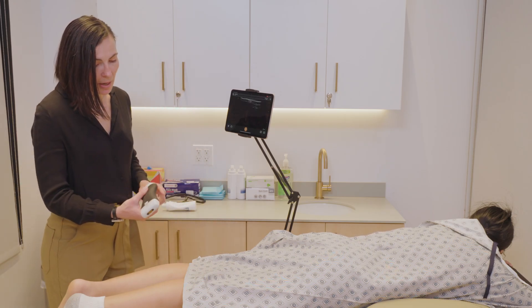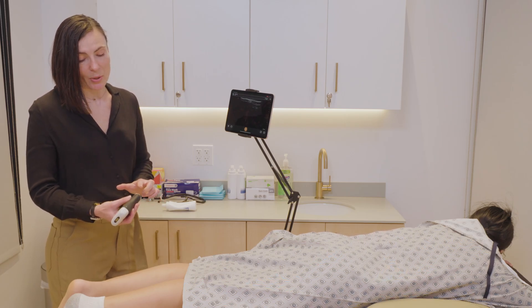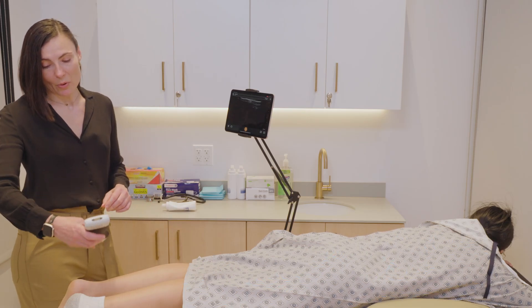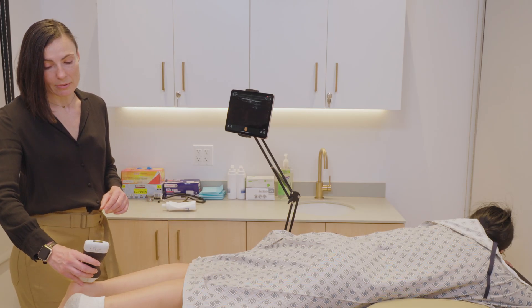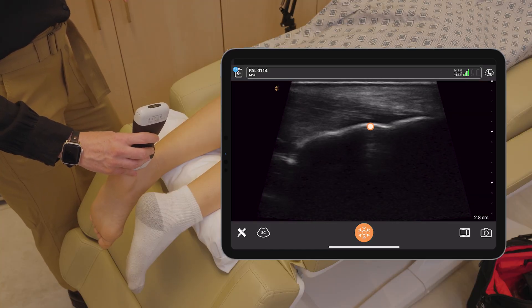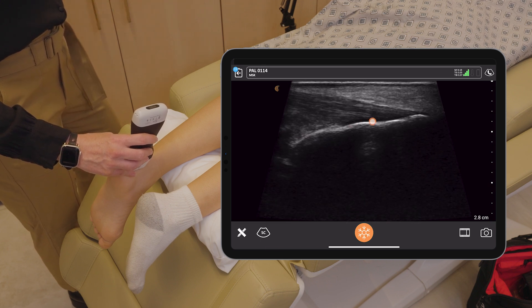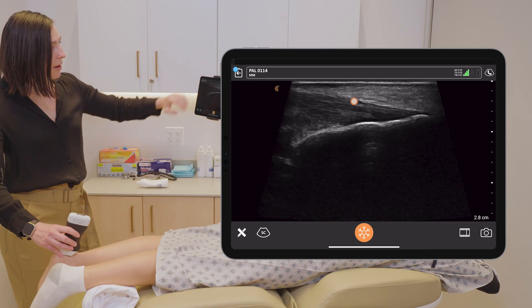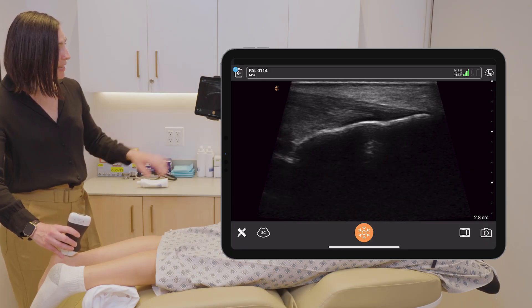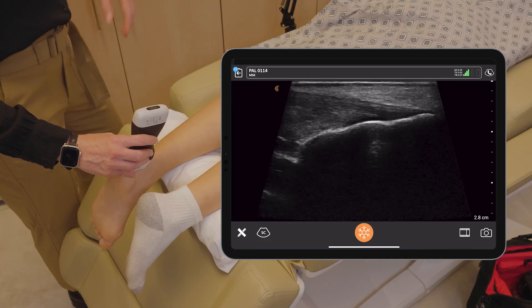I'm going to start with the sagittal orientation first, and my probe marker is going to be pointing towards the patient's head. I will now place the probe over the calcaneus to identify the insertion point. We are seeing it quite clearly — this is the calcaneus, we have a deep shadow underneath it, and this is the attachment point of the Achilles tendon. You're seeing these striations going across the screen.